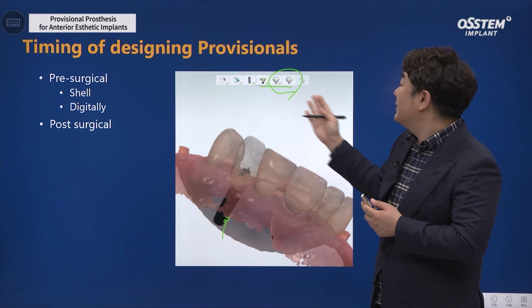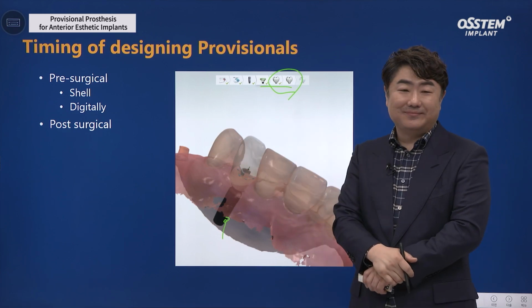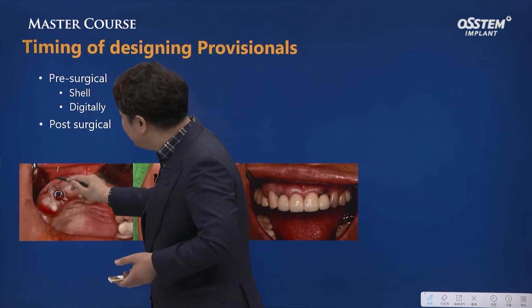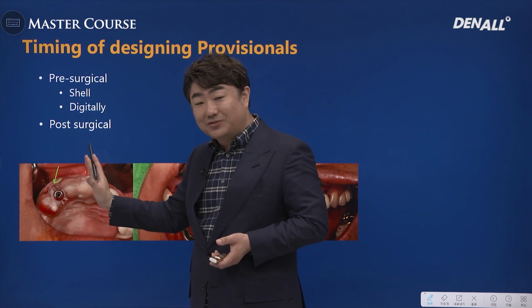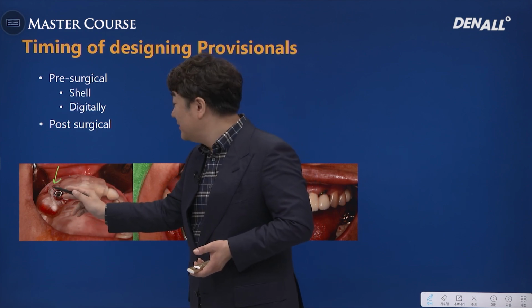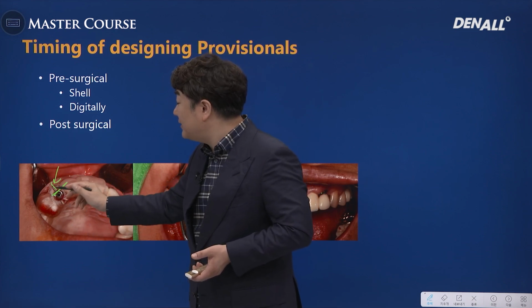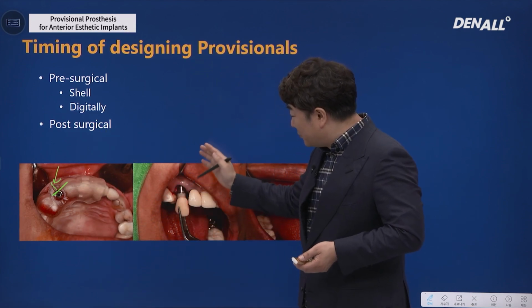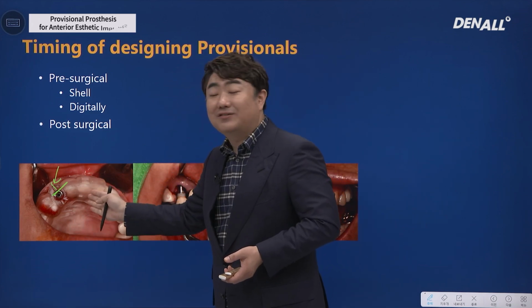If you want to make the design more detailed rather than just doing it here, it's better to use a dental system. Surgical guide and screw-retained crown were fabricated at the same time. As you can see, in Osstem's guide, there is a sleeve slot. This is the hex positioning slot. Using this, you can position the flat side of the internal hex vertical to the slot. If we are to use a hex prosthesis, we can position it accurately.